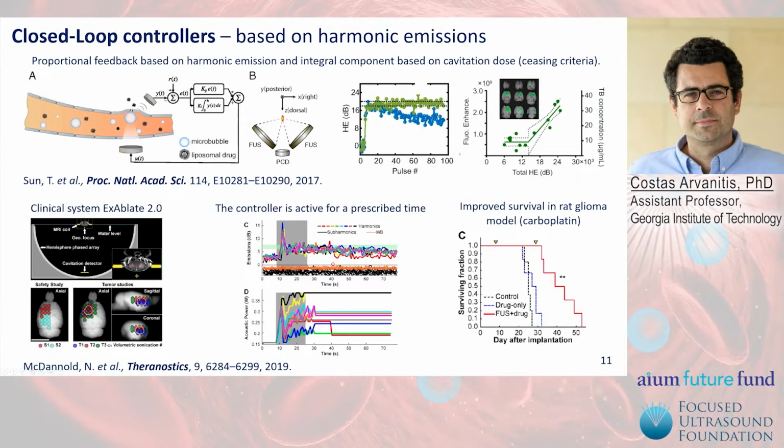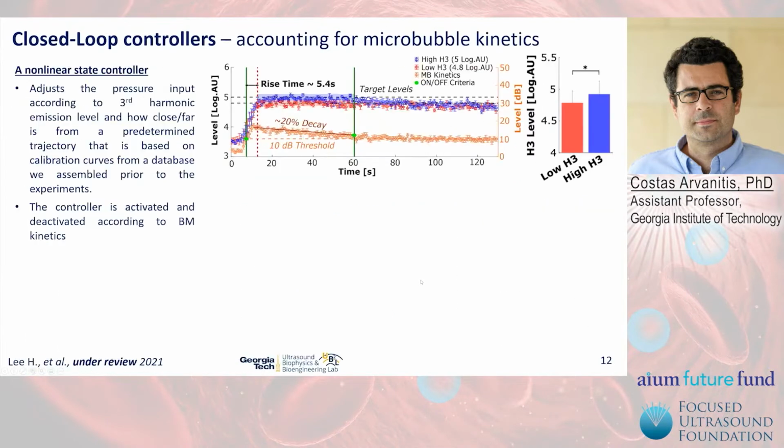However, because of the microbubble kinetics, the controller operates only for roughly 15 to 20 seconds. After that point, the controller keeps the highest pressure that was reached in the last steps until the treatment is complete. Again, extremely good responses have been observed with this controller in glioma models using carboplatin.